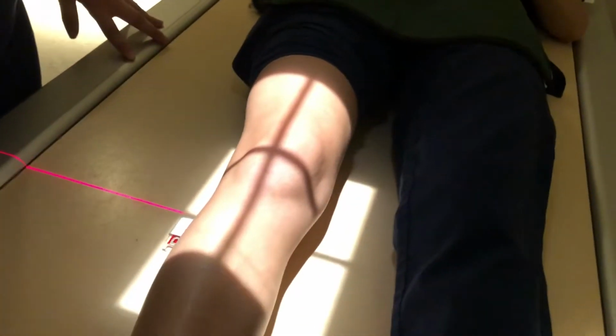We're going to rotate the leg in 3 to 5 degrees. So what we're trying to do is get the tibial plateau parallel with the IR. And a patient like this, we can basically shoot a perpendicular central ray. So that would be a good AP of the knee.